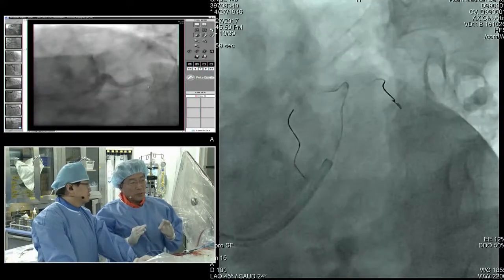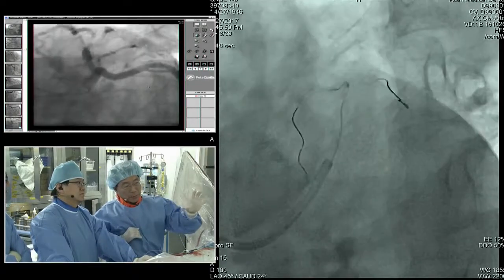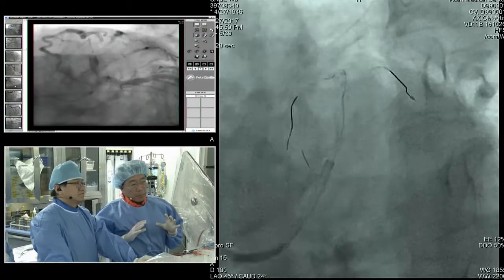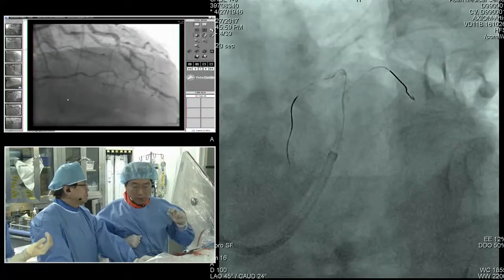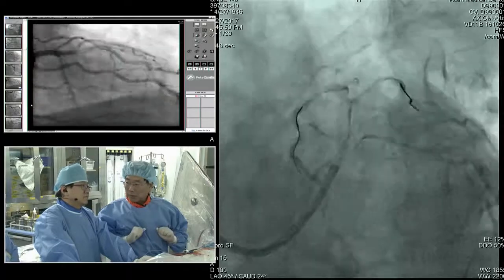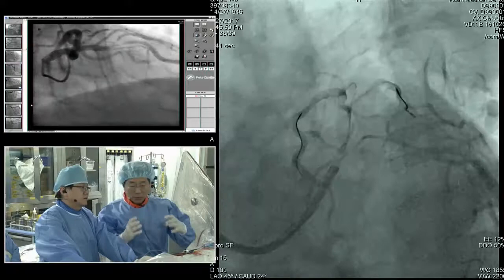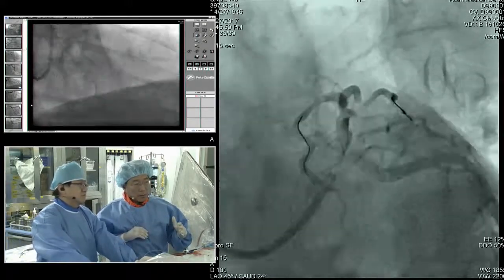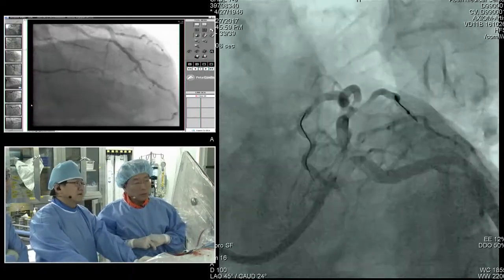It's truly the distal segment of the diagonal branch, and it's not so small. Angiographically it's around 2.5. According to the current data using second-generation drug-eluting stents, we didn't find any difference between provisional T-stent technique, simple stent crossover, and the two-stent technique. Even when we used two stents from the beginning, the clinical outcome is almost the same. So no difference at all.